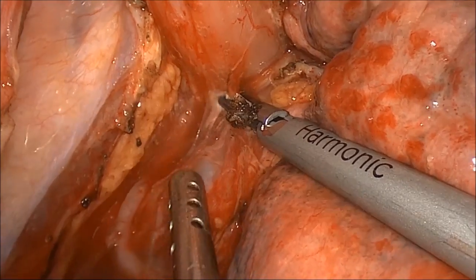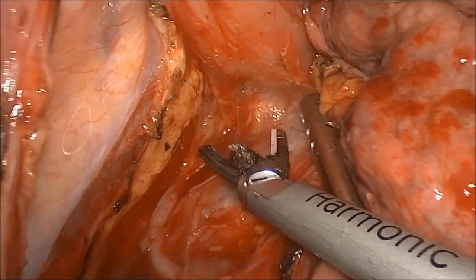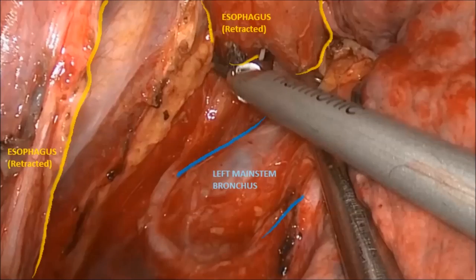Special care is taken to avoid injuring structures such as the membranous portion of the left main stem bronchus, highlighted here.